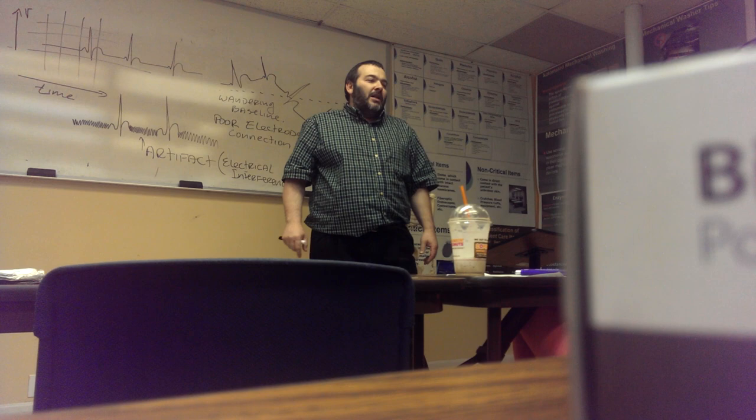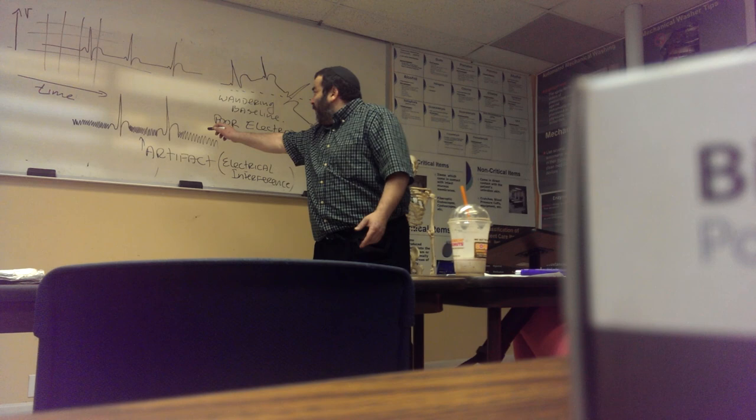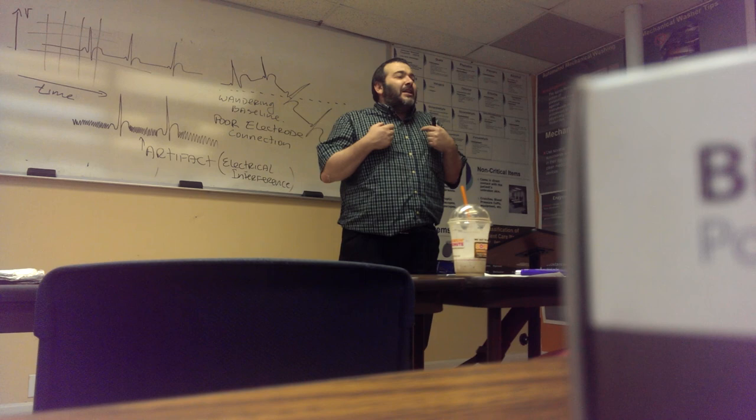Wait a second, but it's the vibrator thing. That's not illegal for the person to have that. No, vibrator. They can do anything they want to. Really, but it interferes with your EKG because it's an electrical impulse. They have to put it out. They just have to turn things off. But if they have too many chains and so on and it interferes with your stickies, then yes.